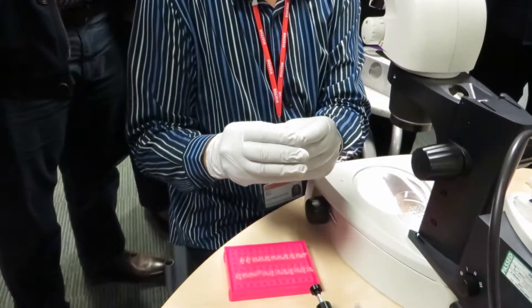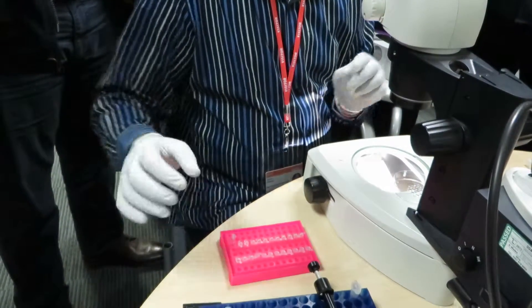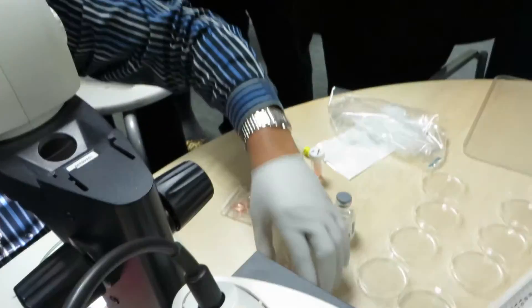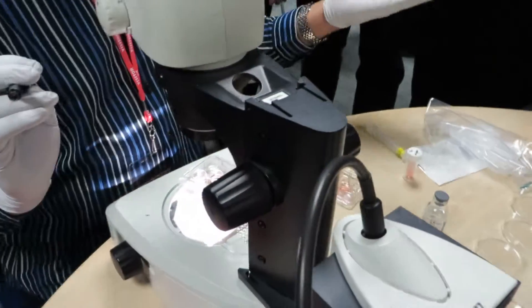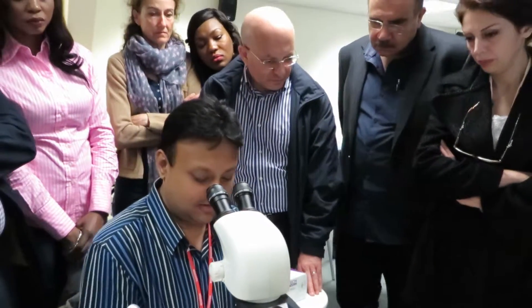When you open the tube, you have to do it very aseptically — obviously you'll be in a class 2 cabinet. Usually your embryologist will give you just one of these round dishes with the cells there.